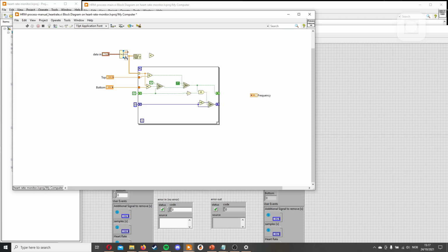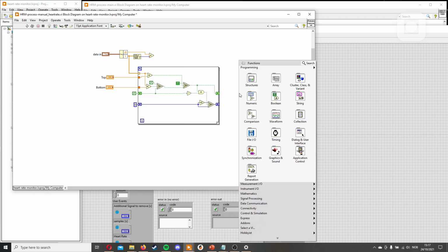Currently, by default, we have 10 seconds of data, and our timing is every millisecond, or 1000 hertz. So this will be 0.001. So we'll multiply 0.001 with 10,000. This will give out the value of 10, which means we will have this many peaks over 10 seconds. So if, say, we have 20 peaks over 10 seconds, we have 2 hertz, which would be 120 beats per minute. But we'll do the calculation afterwards. Right now, we're just interested in the data.